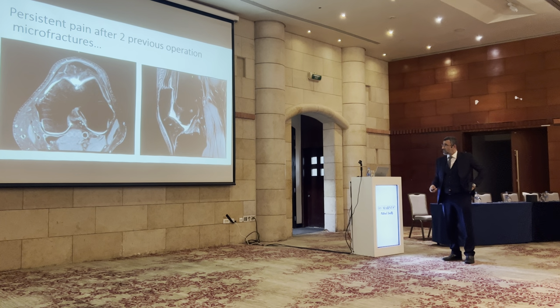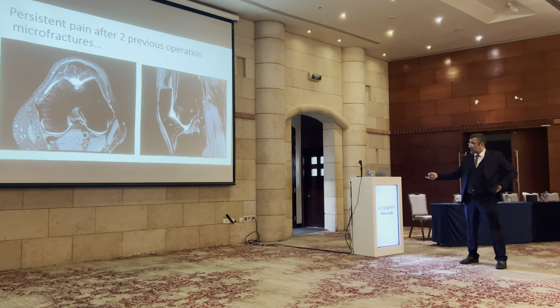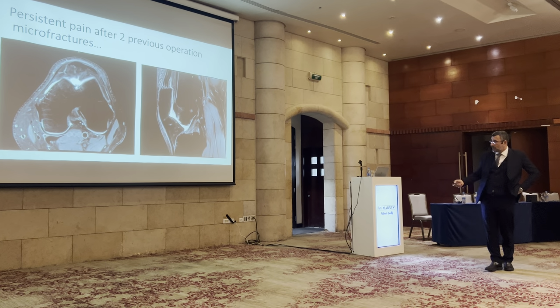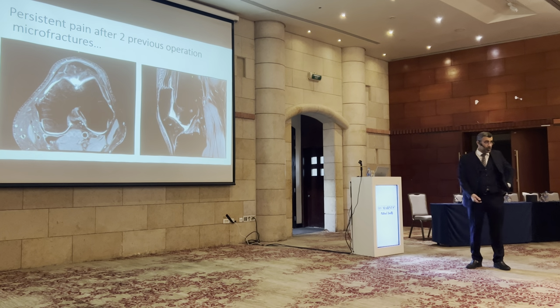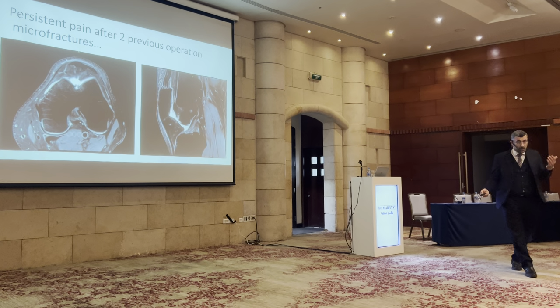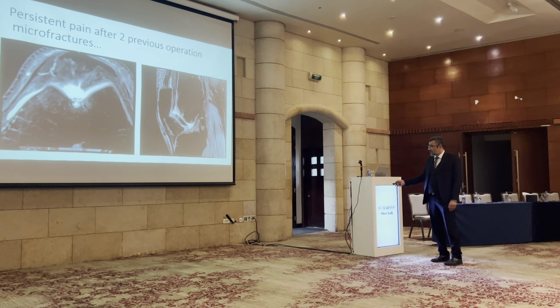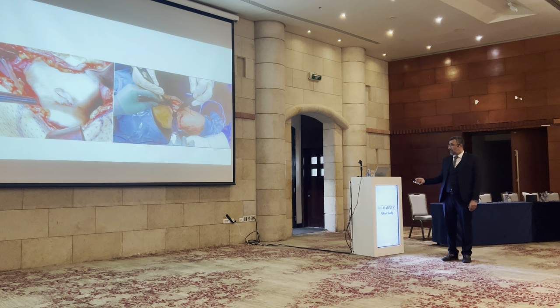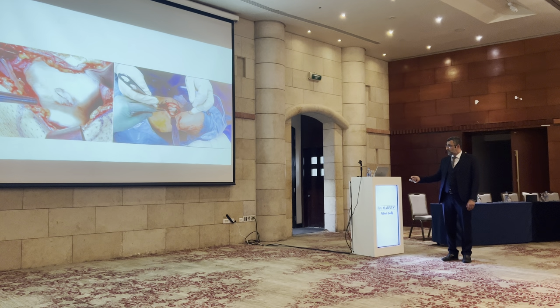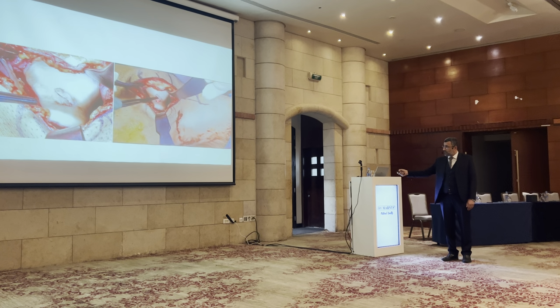This patient comes from outside Jordan. He had 2 microfracture surgeries in a very famous place in the Gulf and failed. Why the failure? This is decision-making. Failure because the subchondral bone is diseased. So with subchondral bone disease, don't do microfracture, you don't replace it. You replace the bone, osteochondral bone. You see, here it's diseased. So what we have done, open osteochondral transfer, and you see here how it's moving, unstable fibrocartilage.